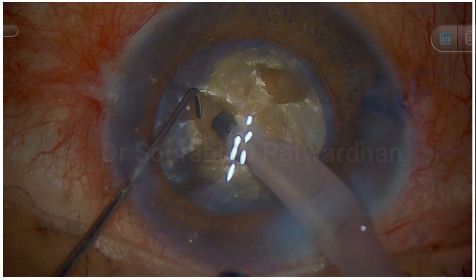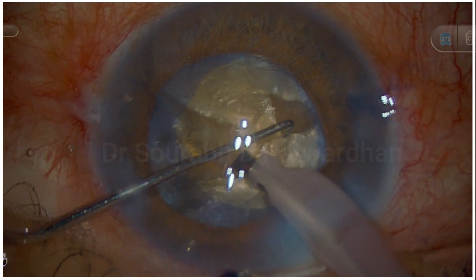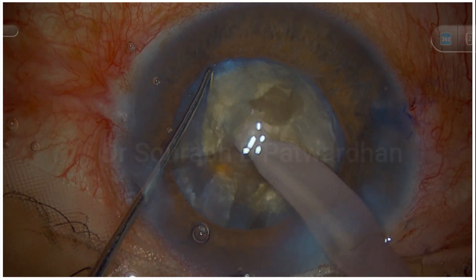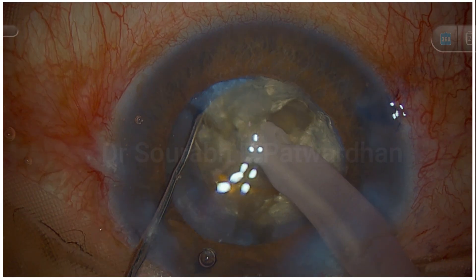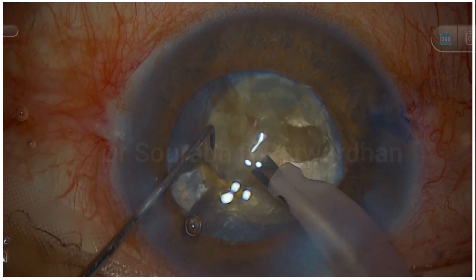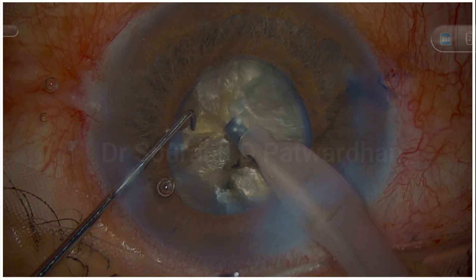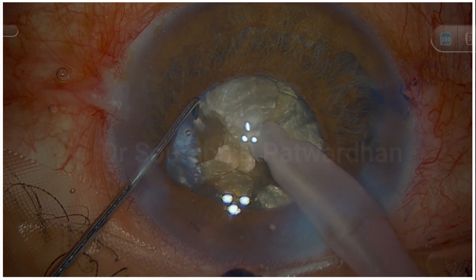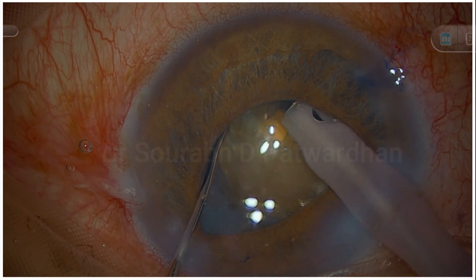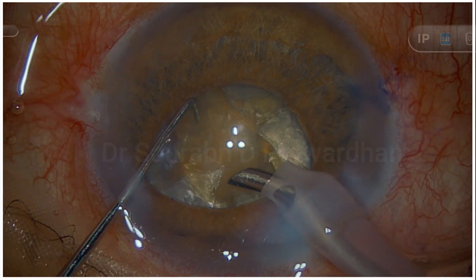Once the initial half of the posterior plate was cracked, the surgeon tried the opposite 180 degrees and achieved the crack. Again trying to chop the partially chopped hemi-nuclei — as expected, it's difficult because once you've done a partial division, the nucleus tends to separate at the same planes. The initial crack was not all the way to the posterior plate, which is why the surgeon is having difficulty. The surgeon tries to chop further, and the endonucleus gets separated from the rest of the nucleus, which is good — the surgeon can then emulsify that endonucleus part.